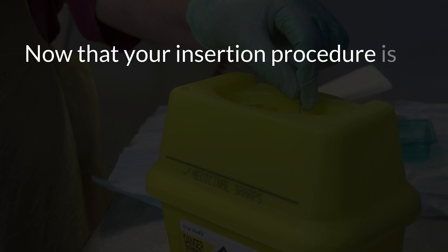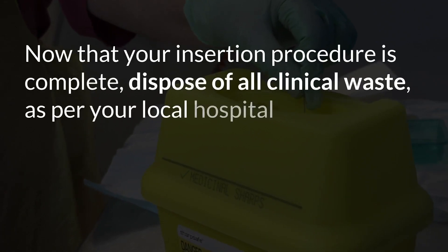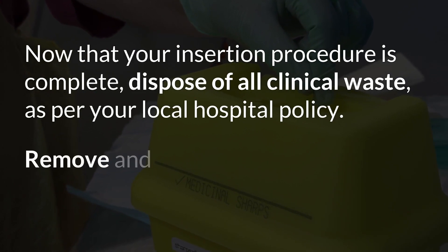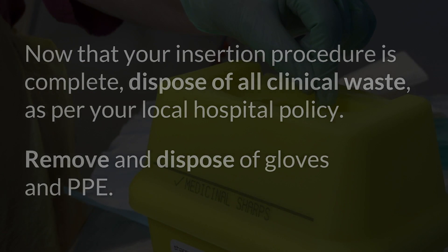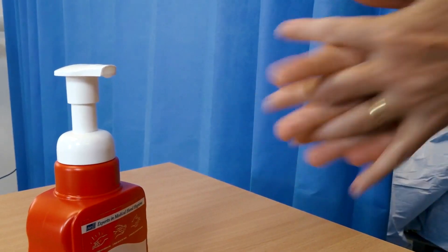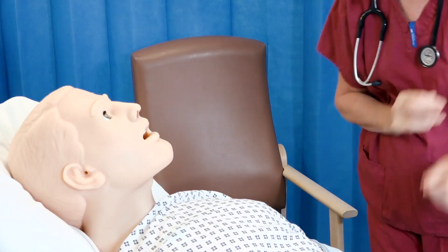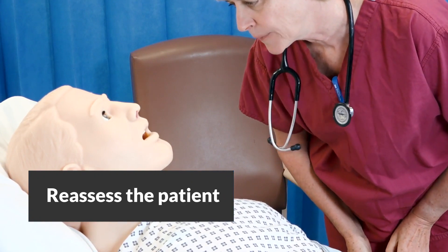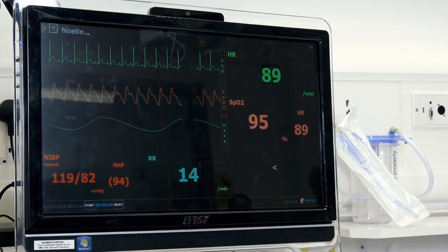Now that your insertion procedure is complete, dispose of all clinical waste as per your local hospital policy. Remove and dispose of gloves and PPE. Reassess your patient, noting vital signs, respiratory function, pain and sedation levels.